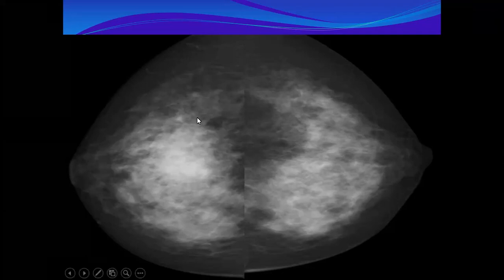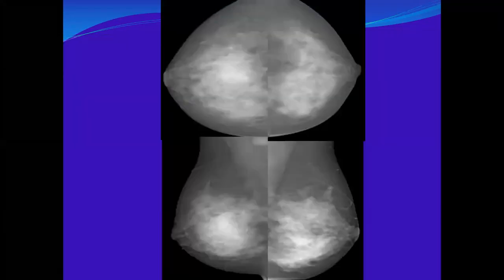You are talking about this or a different place? Yes, about this. So this is the anterior, this is the middle, and this is the posterior. In the middle. Okay, this is outer, this is inner, and this is central. So it is mid-central toward posterior, meaning from the middle to the posterior depth of the breast. This is the asymmetry. And good that you picked up that there are subtle changes regarding the nipple.